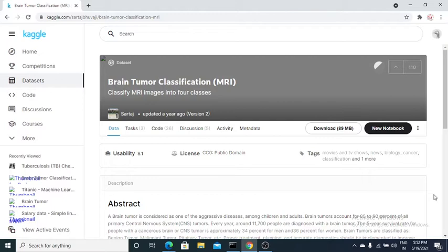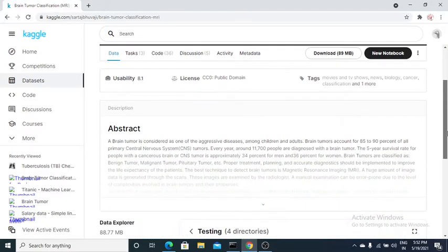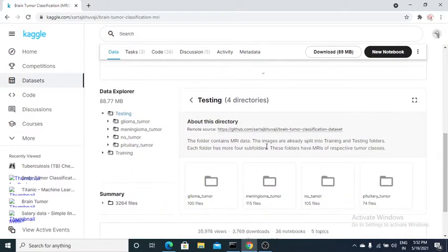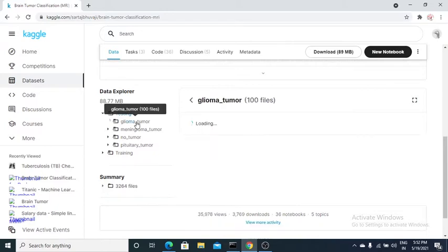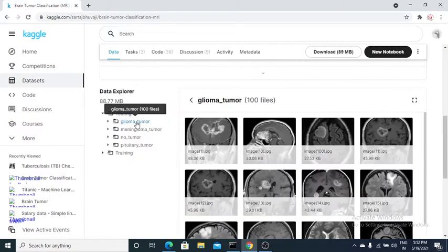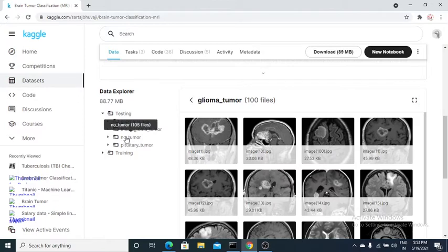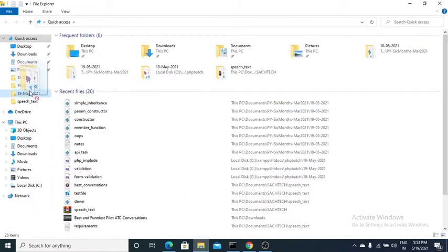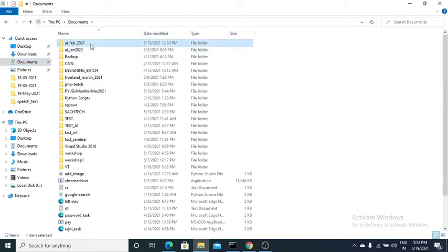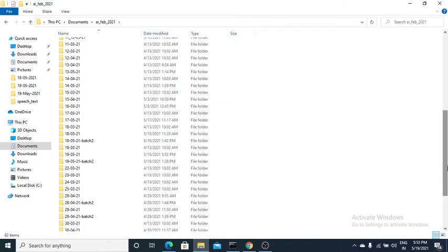I'll build a predictive model for brain tumor classification on a dataset containing a significant number of MRI images. The dataset has two folders — test and training — with different classes of tumors. I'll keep it simple and use only two of those classes: pituitary tumor and no tumor. I have downloaded this dataset into a local folder.